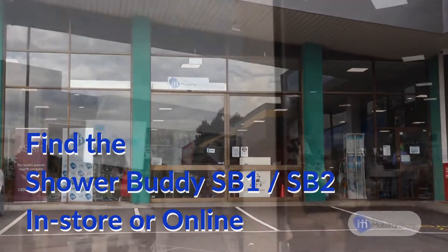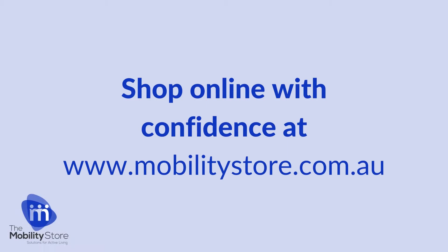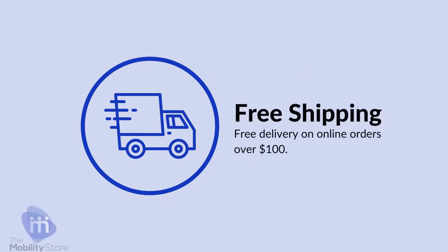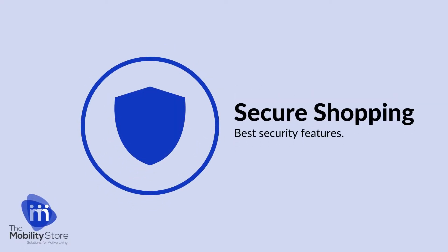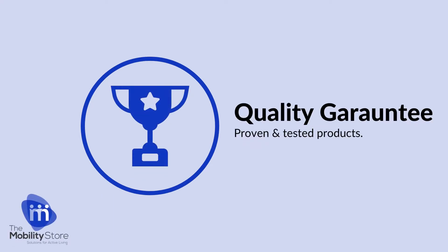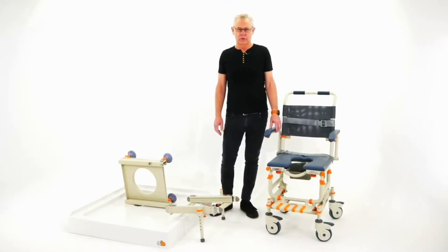I'm talking to you today as a representative of ShowerBuddy, and you're watching because you need a solution to your non-accessible bathroom. ShowerBuddy can make your bathroom accessible in a short space of time and at a very economic cost. We have many solutions for your bathroom, and today I'm going to demonstrate the original ShowerBuddy.